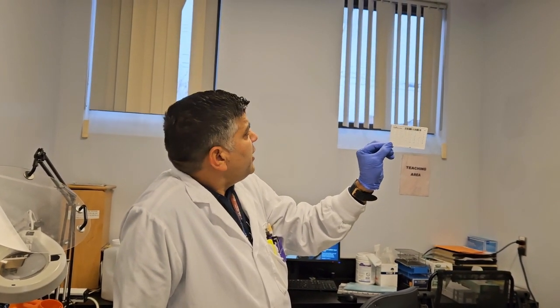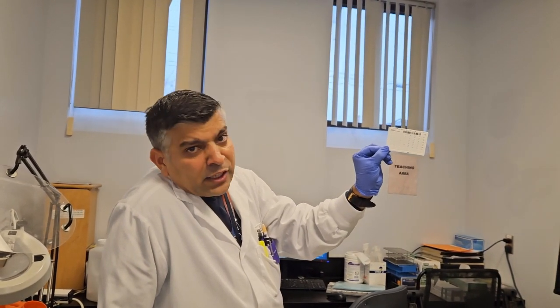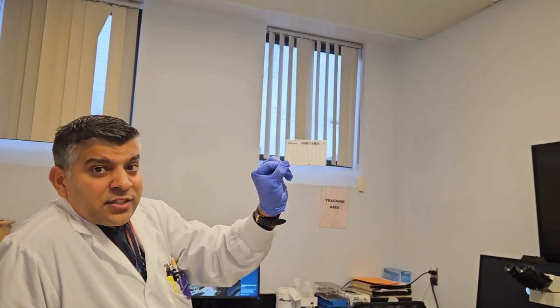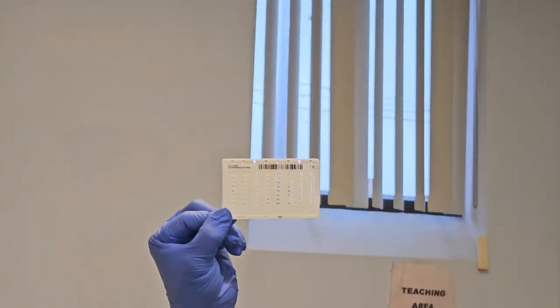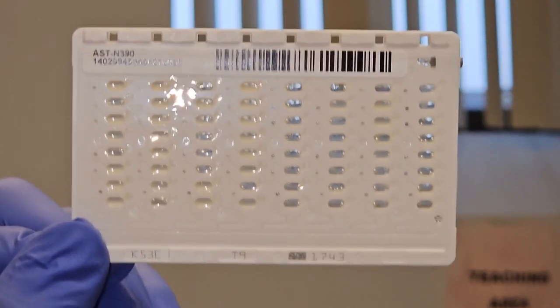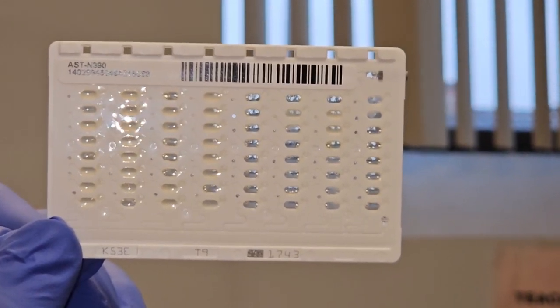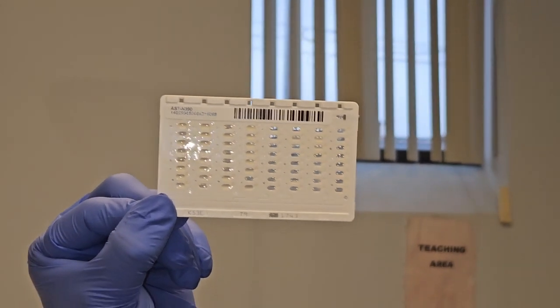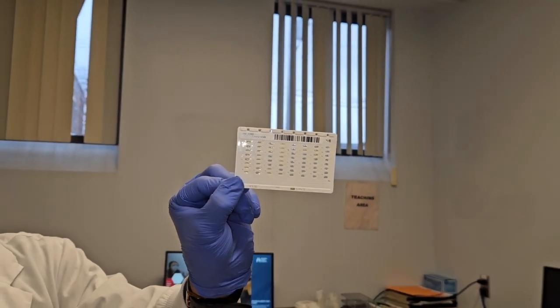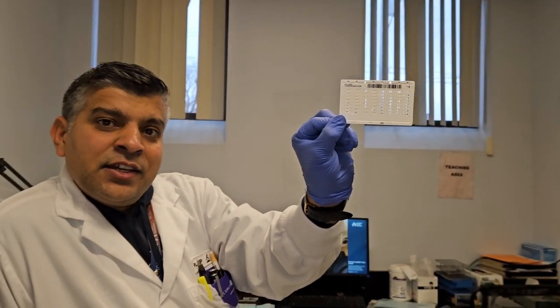So what is happening in here is you can see in close view some of the wells, like micro wells. You can see the growth, turbidity indicating the growth, versus some of them you can see the clear. So the turbid well means that's not the MIC, minimum inhibitory concentration of the antibiotic, indicating there is some resistance, versus the well next to the growth well, whenever there is a clear well, that indicates that's the MIC, indicating bacteria are sensitive to that particular antibiotic.